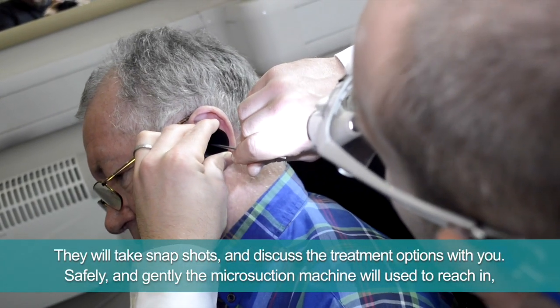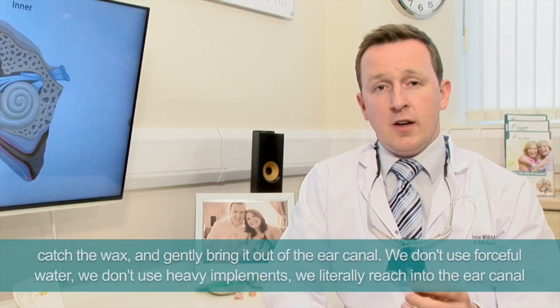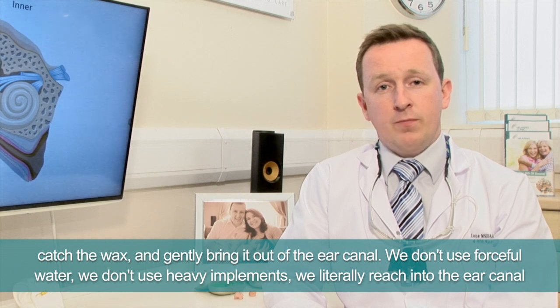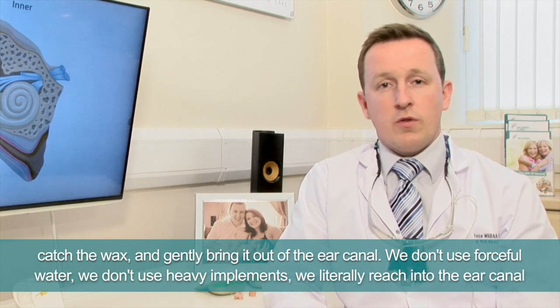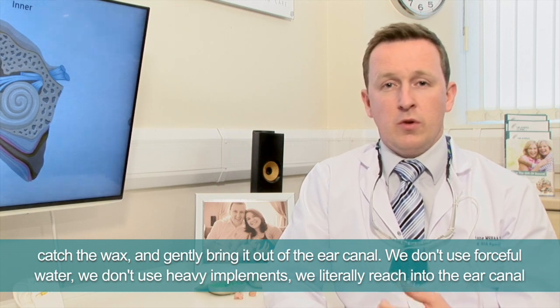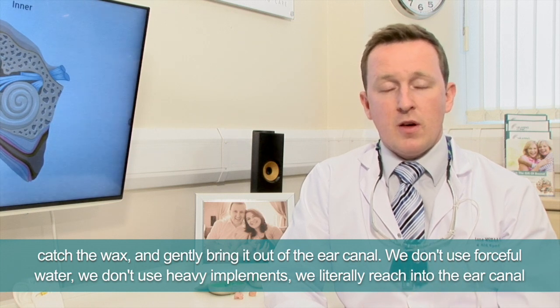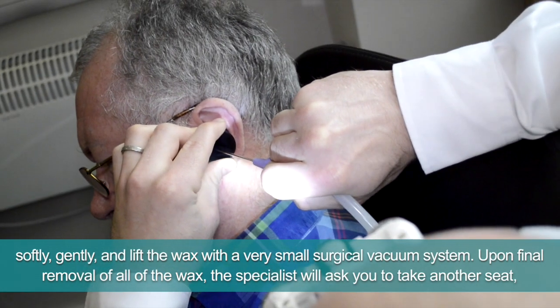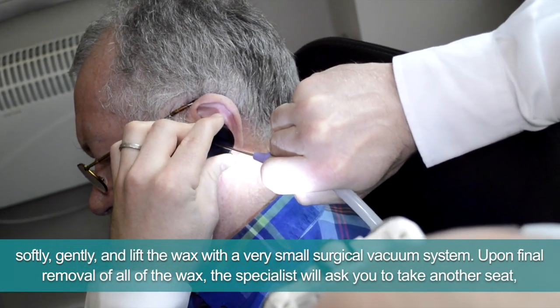Safely and gently, the microsuction machine will be used to reach in, catch the wax, and gently bring it out of the ear canal. We don't use forceful water, we don't use any heavy implements — we literally reach into the ear canal softly and gently, lifting the wax out with a very small surgical vacuum system.